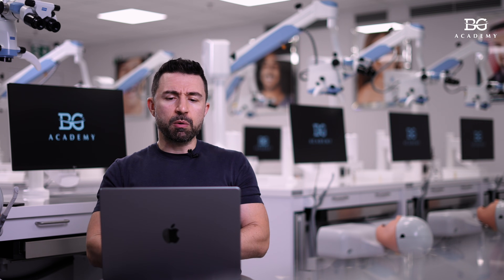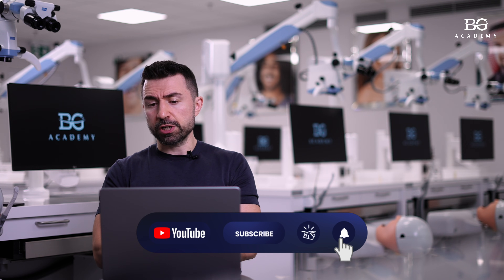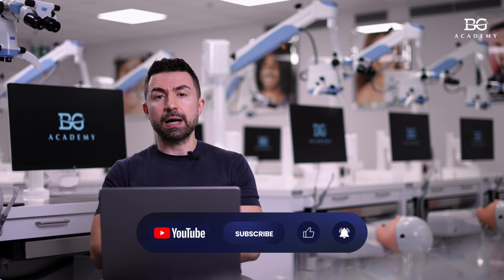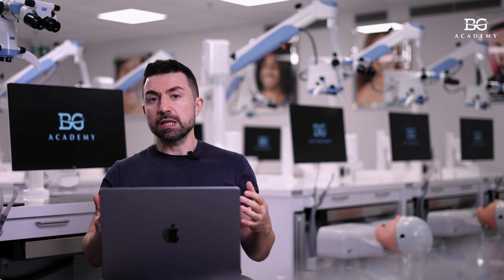Dear friends, welcome to our new episode of the BG Dental Tips. This time I will show you some interesting cases related to tooth preparation, especially when we have composite restorations and we want to make our prep and the finish line on the tooth surface rather than on composite.